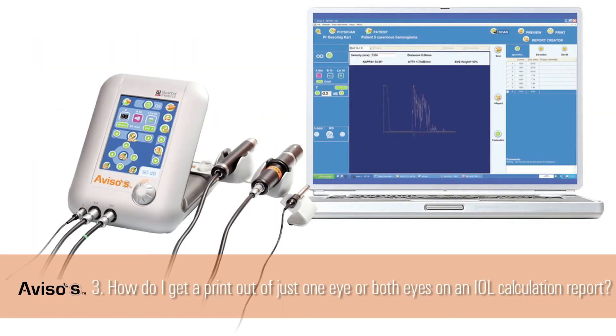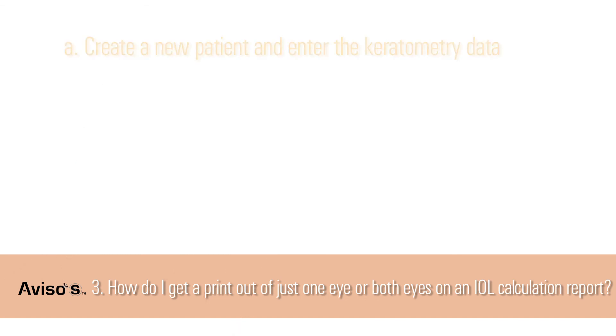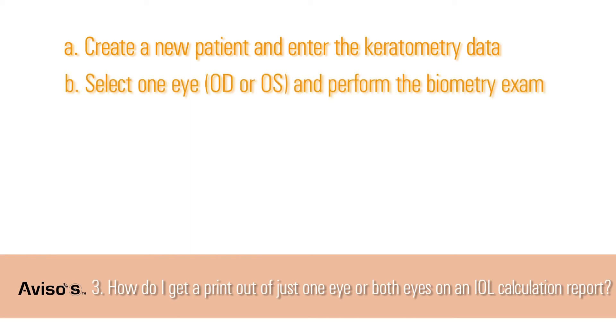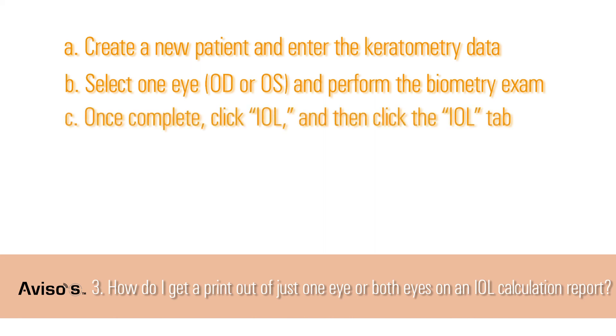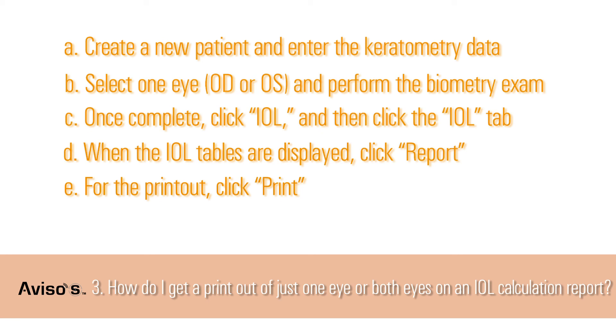Question 3: How do I get a printout of just one eye or both eyes on an IOL calculation report? To produce a printout of one eye's IOL calculation: A. Create a new patient and enter the keratometry data. B. Select one eye, OD or OS and perform the biometry exam. C. Once complete, click the IOL icon and inside the new window click on the IOL tab. D. When the IOL tables are displayed, click on Report. E. For the printout, click Print and select your preferred printer.